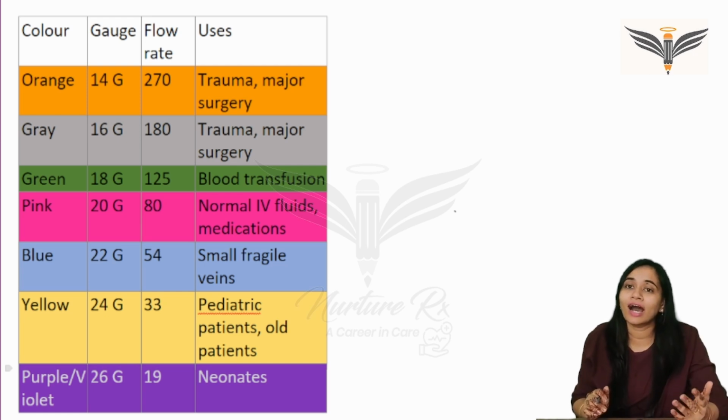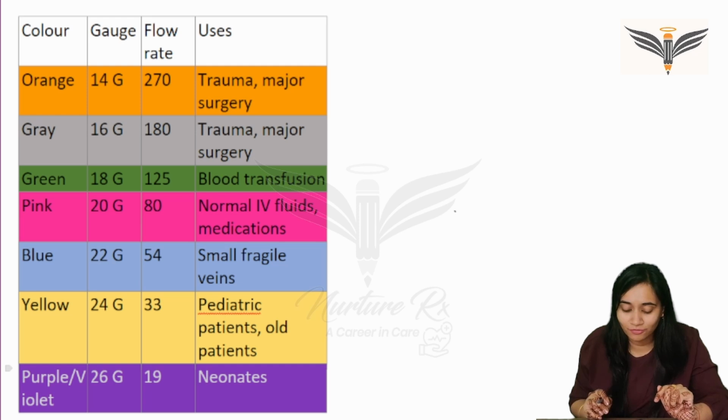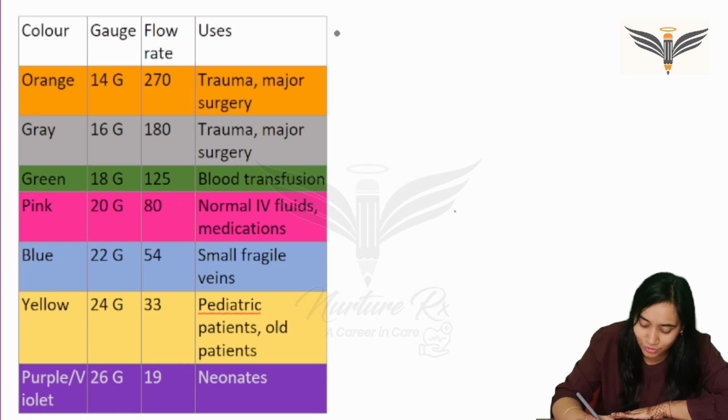Now you will say, how are we going to remember this color coding according to the sizes? For that I have a mnemonic for you, and I have it both in Hindi as well as in English. Let me share it with you.